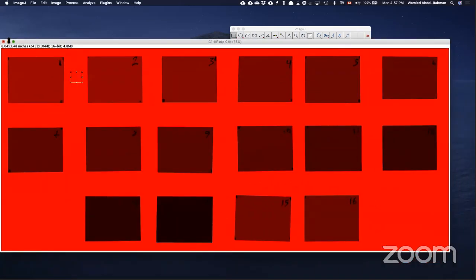So this is how we were doing it manually. It's tedious, but the nice thing is, once you have done it for a batch of films, a batch of film has 25 large pieces of film, so you can use them for a year or two. Sometimes we check this calibration, because I heard that if the films are exposed to ultraviolet light, it might affect the dosimetry of the film. So every year we establish these curves.